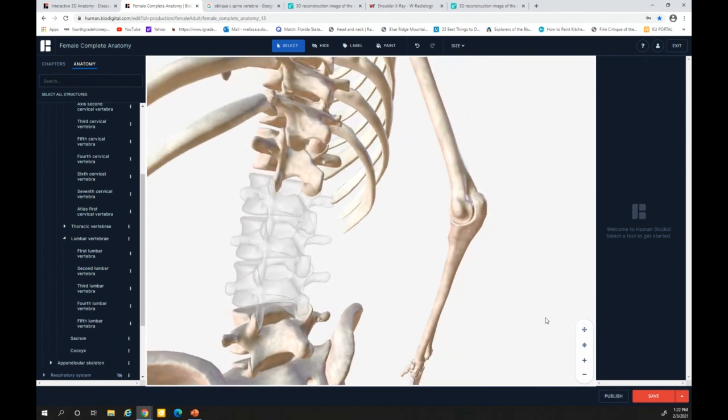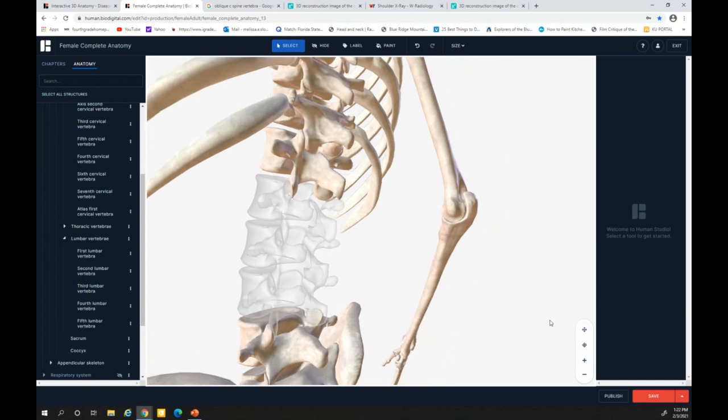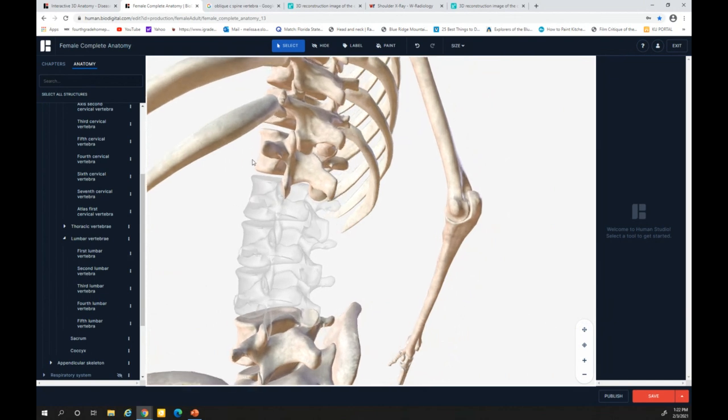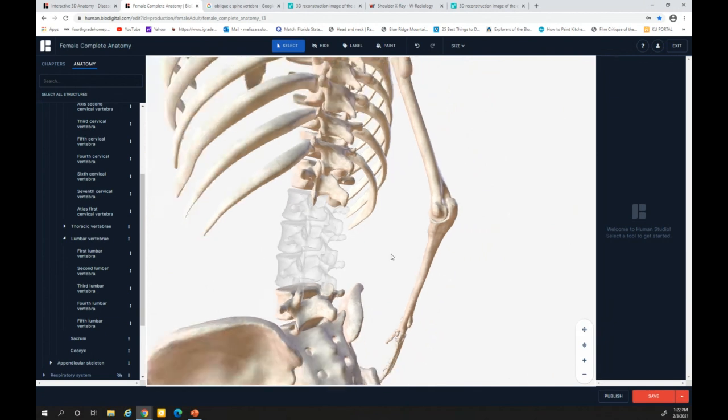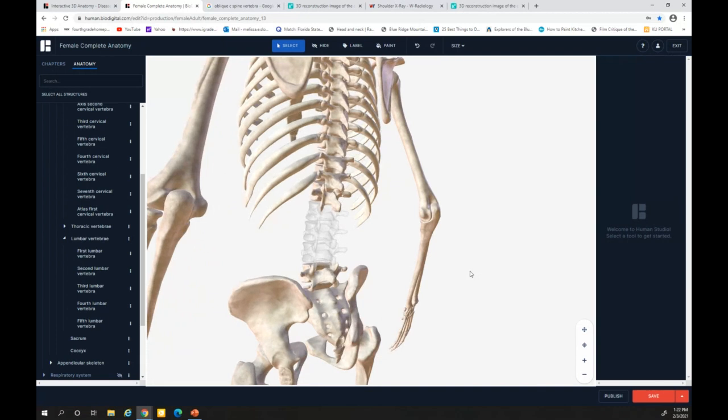RAO. Go back to RAO again. And we can see this one better because we're right there on that side away. Let me get him there. Okay, so you can see the ilium there coming away from the bucky. That's why we can see it better like this.